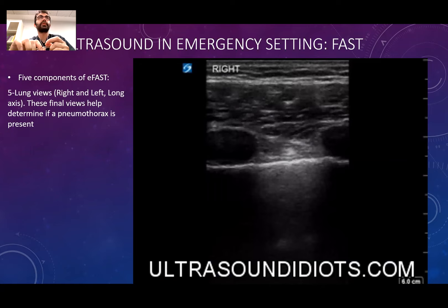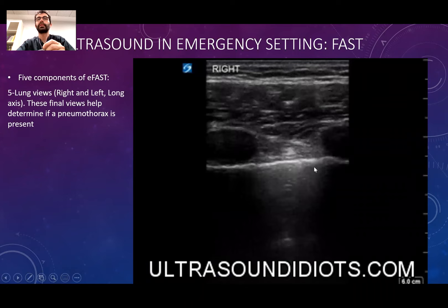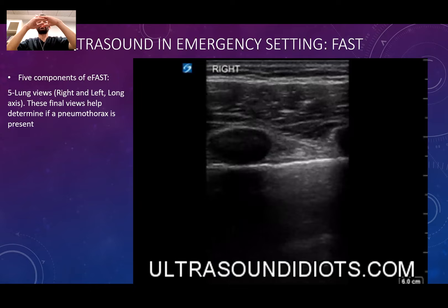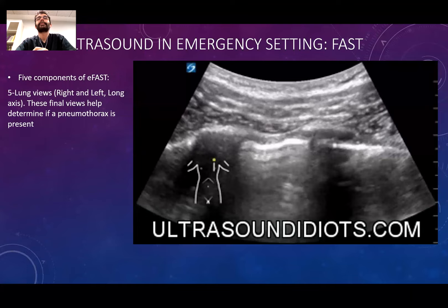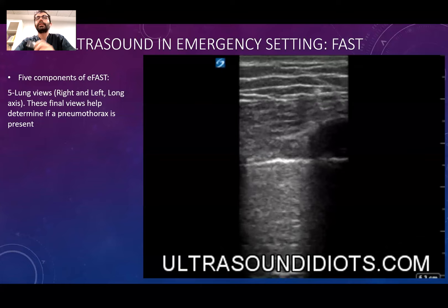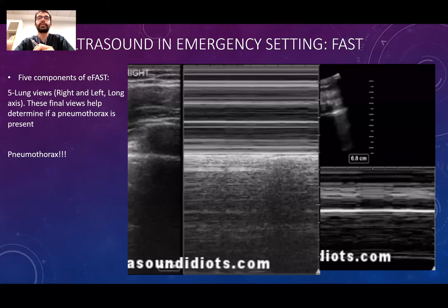When checking the pleura, the pleura is usually sliding left and right between the pleural lines. When there is pneumothorax, because the lung pleura becomes separated, the sliding movement disappears. Just like in this case — there is no sliding movement, the image just stays still.